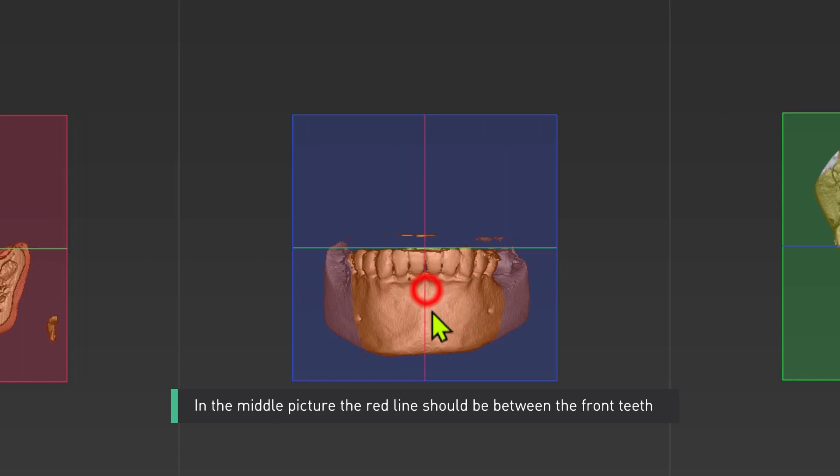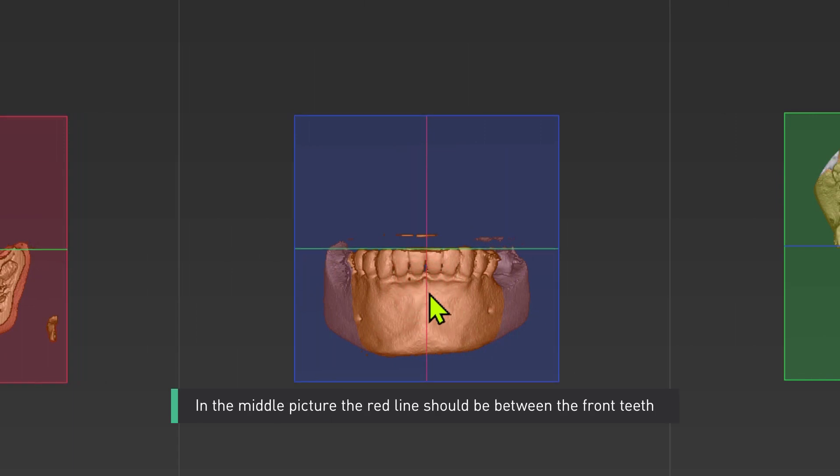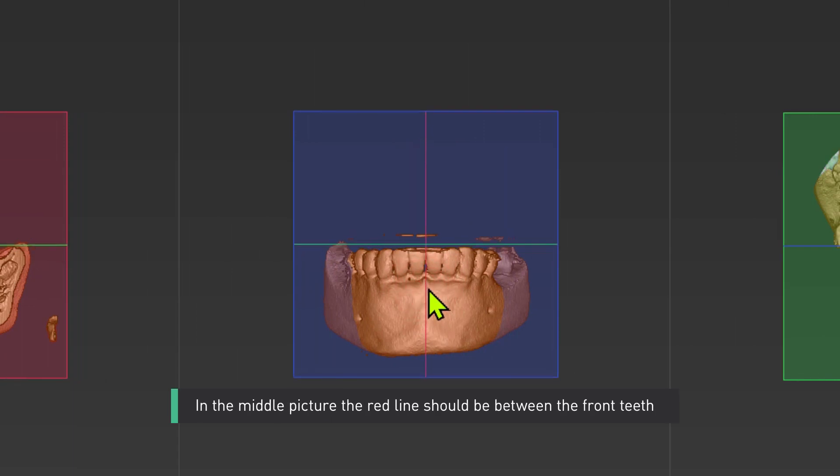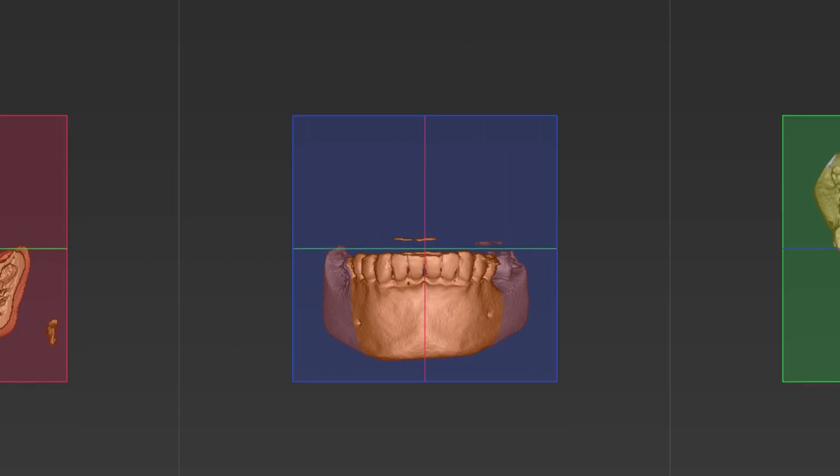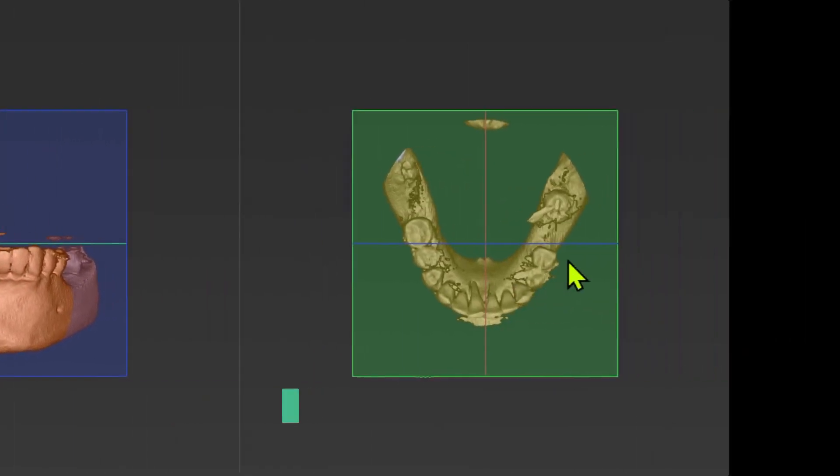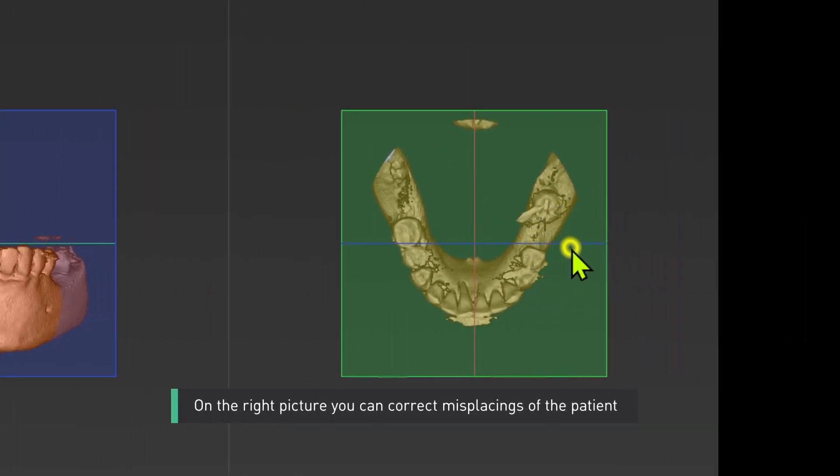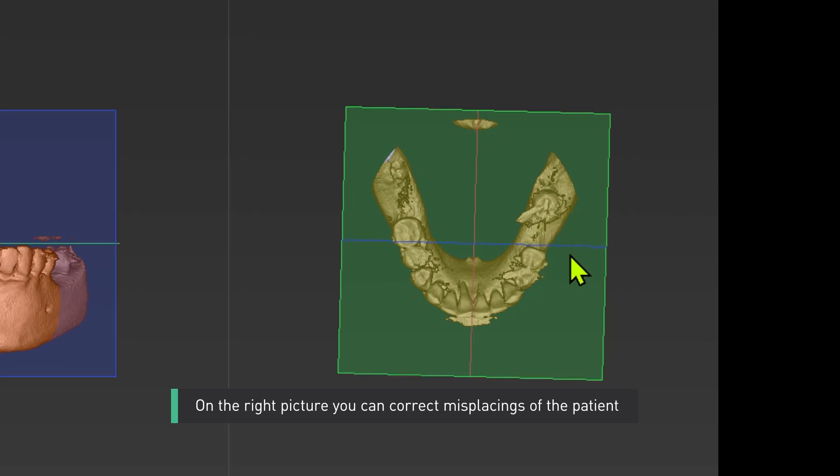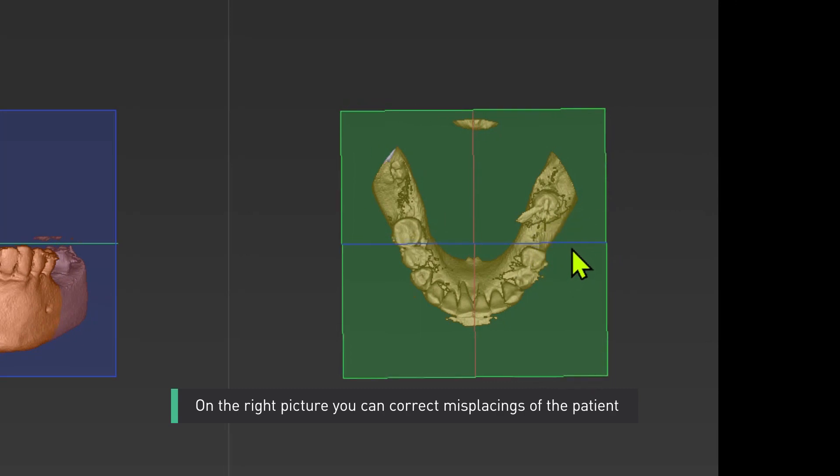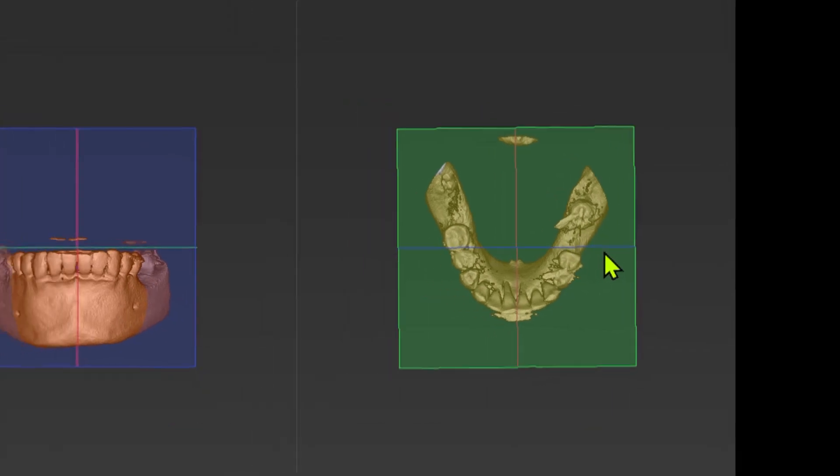In the middle picture the red line should be between the front teeth. On the right picture you can correct misplacings of the patient.